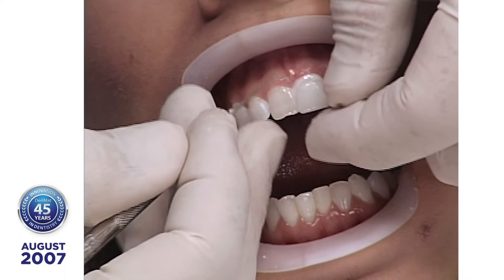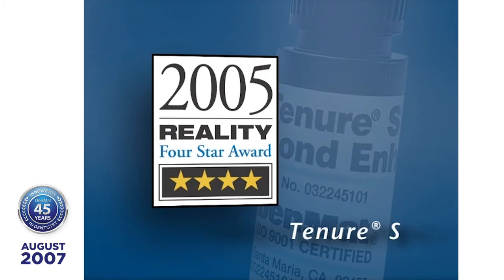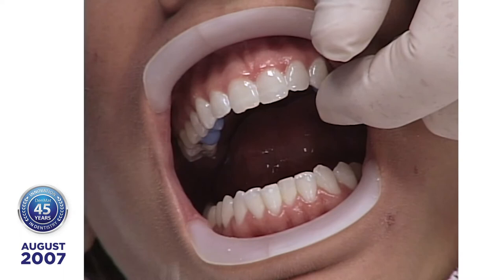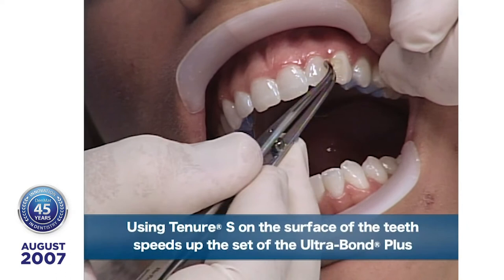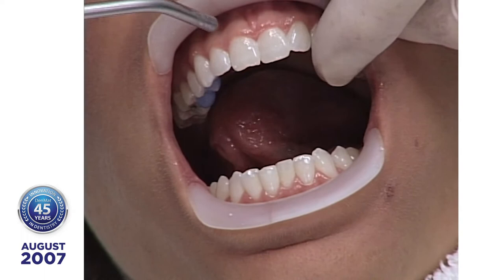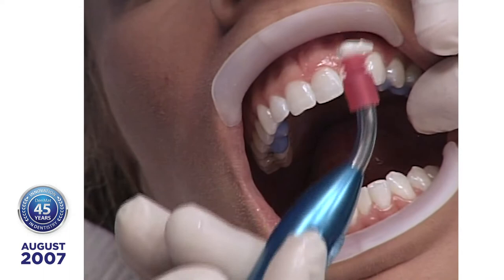Now I'll start removing the tri-in paste. Jessica will use the tenure-S to remove the tri-in paste inside the lumineer. If she doesn't get it all out, any remaining resin will be polymerized with the tenure-S. So if you're doing a try-in, don't put the tenure-S on first — put it on after you've done your try-in and selected your shade. Coat all of your etched, conditioned surface with resin, because once you've conditioned your teeth a race begins between resin and contamination.